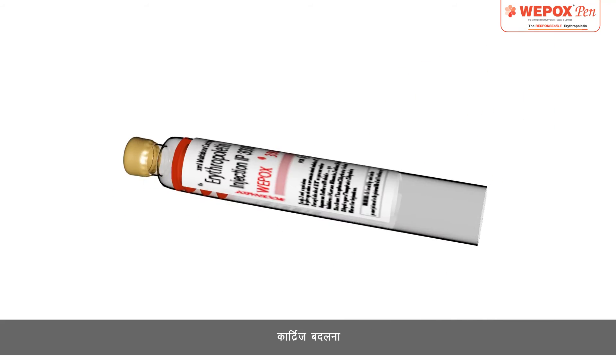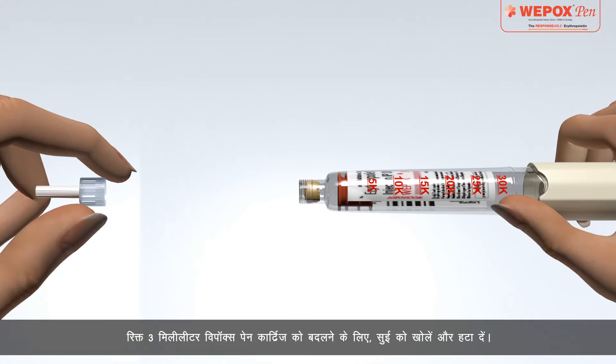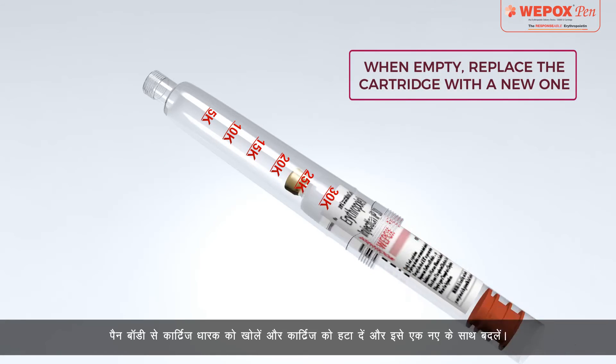Replacing the Cartridge: To replace an empty 3ml Wipox pen cartridge, unscrew and remove the needle. Then unscrew the cartridge holder from the pen body, remove the empty cartridge, and replace it with a new one.